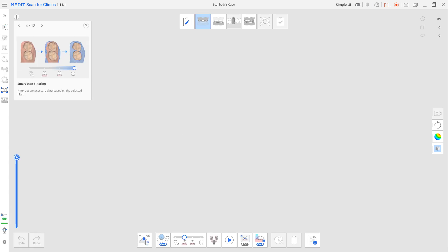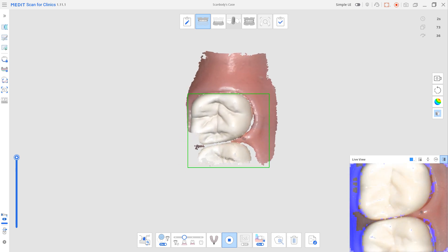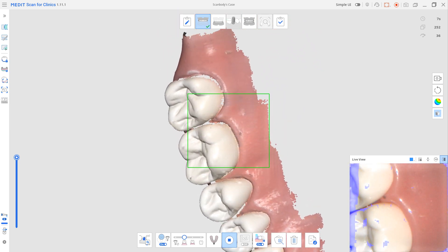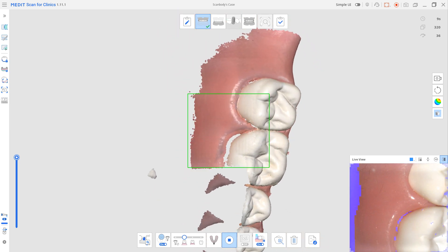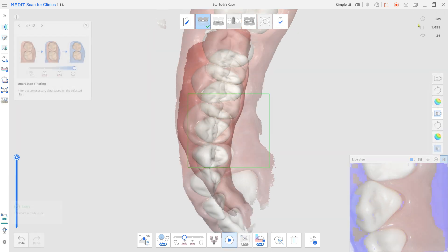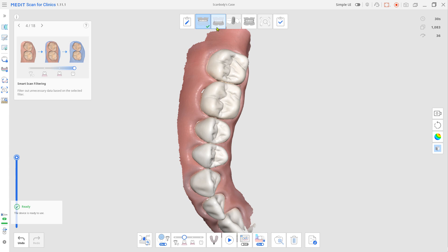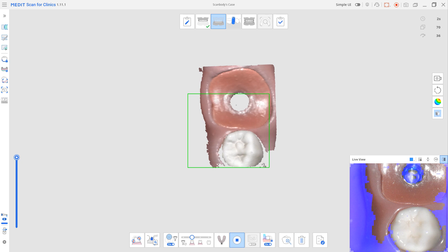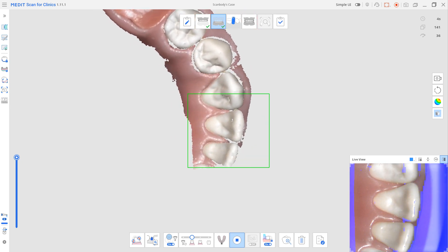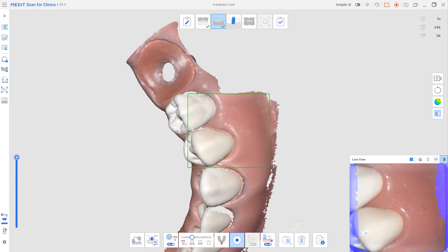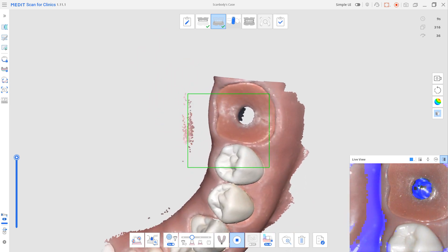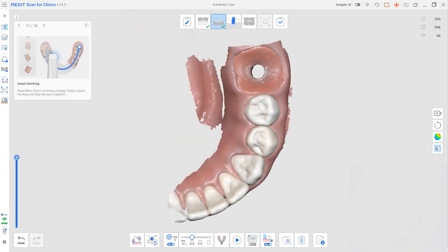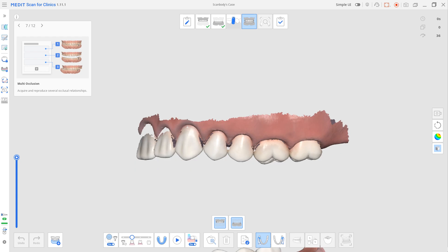Scan the antagonist. Remove the healing abutment from the patient's mouth and scan the implanted arch. Have your patient close bite and scan the occlusion.